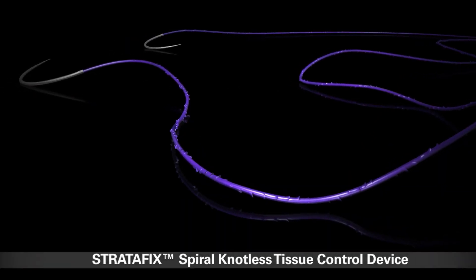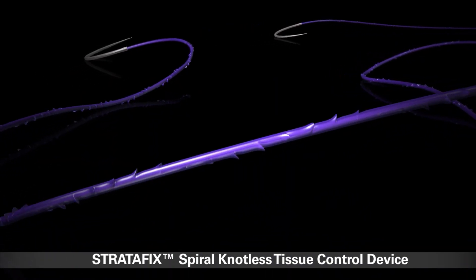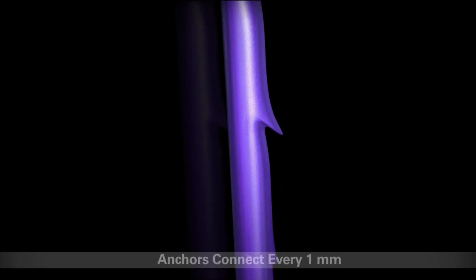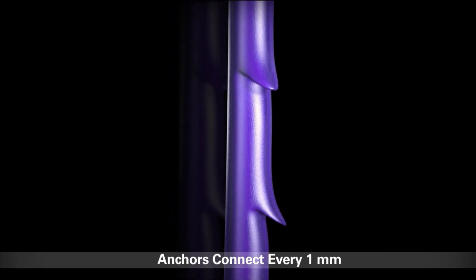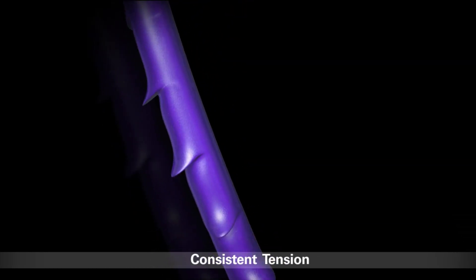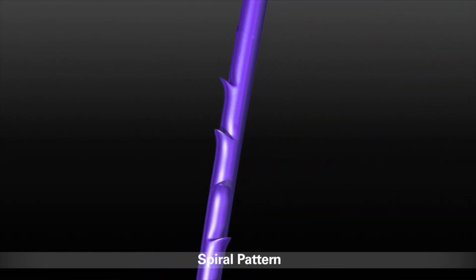The Stratafix spiral knotless tissue control device is the next evolution in wound closure and tissue repair. It features unique anchors that connect with tissue every one millimeter, eliminating the need for knots and ensuring consistent tension and fixation across the incision. The anchors are cut into the core of the suture in a spiral pattern.